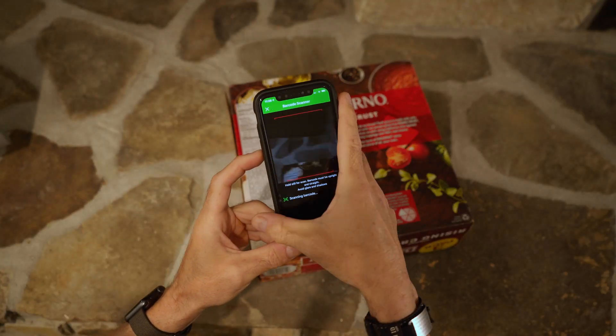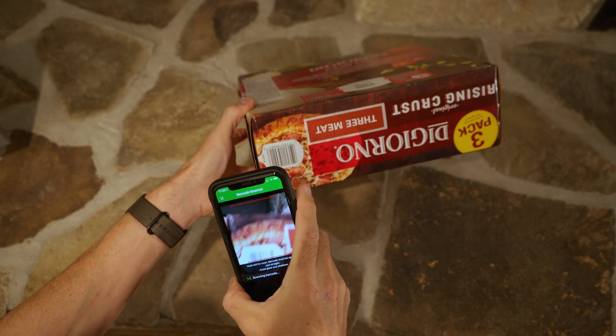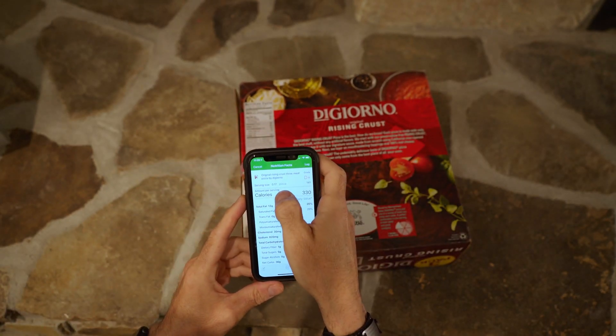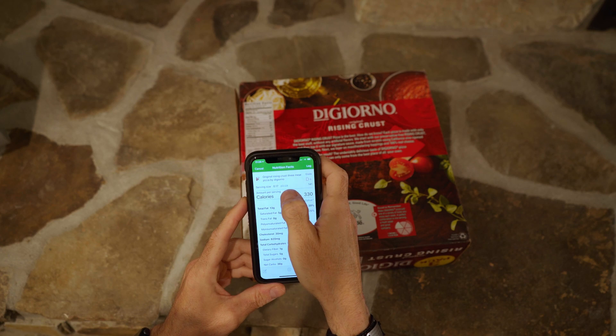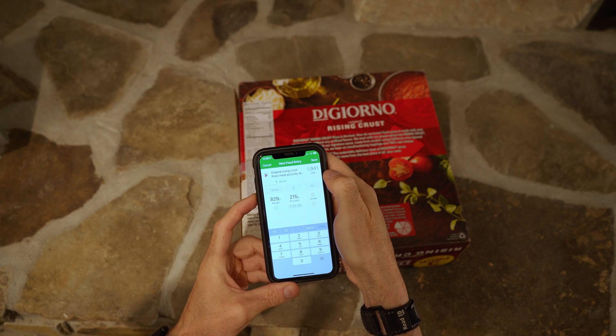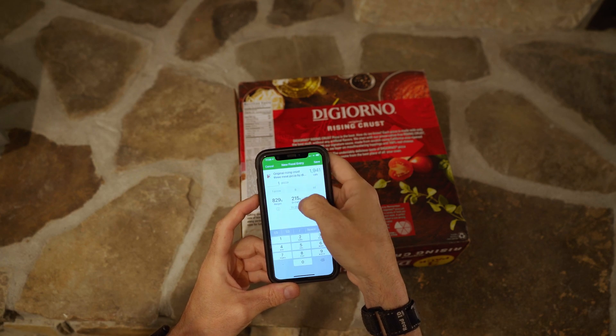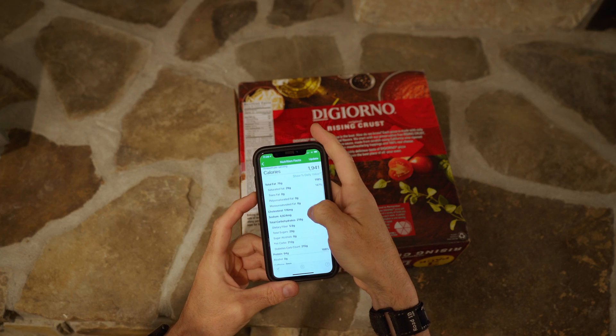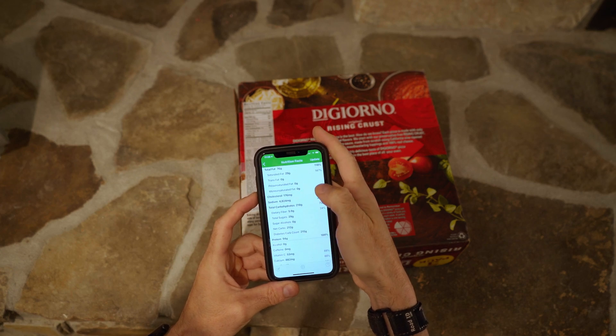We can use the barcode scanner in a nutrition app to scan the box. It comes up as one sixth of a pizza for a serving, but I will change it to the entire pizza, which is 1,941 calories, 215 grams of carb, 76 grams of fat, and 94 grams of protein.